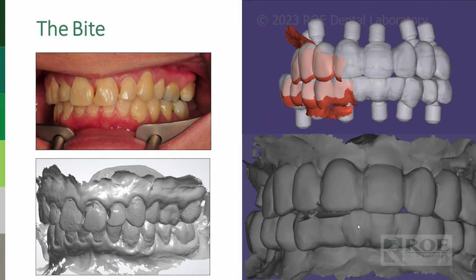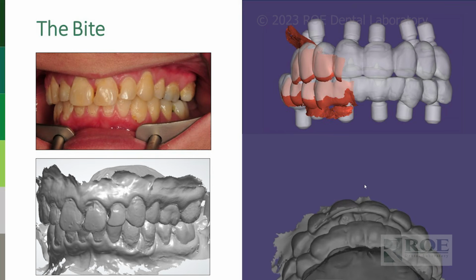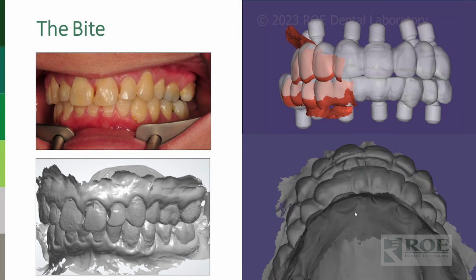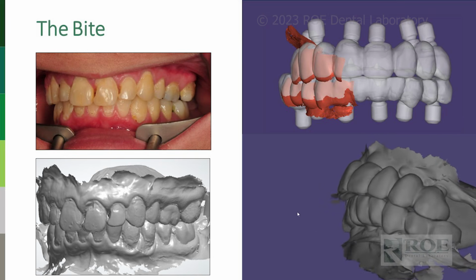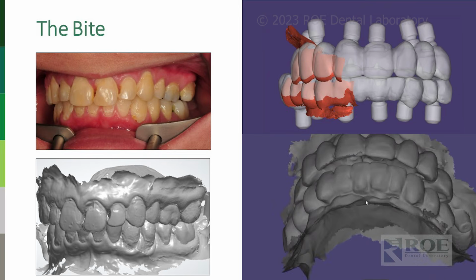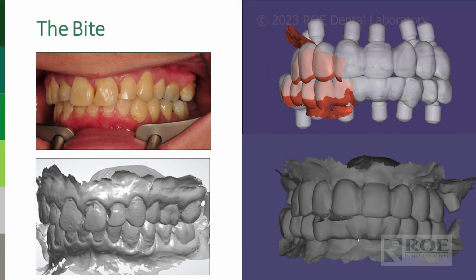Here I have a little video showing overbite and overjet. You can also test this when you have your scanner: turn the patient down, turn the patient up, look at the insides of the teeth, and then turn one arch on and off. You'll see that the teeth are overlapping or not even in contact at all. So bilateral is very important.